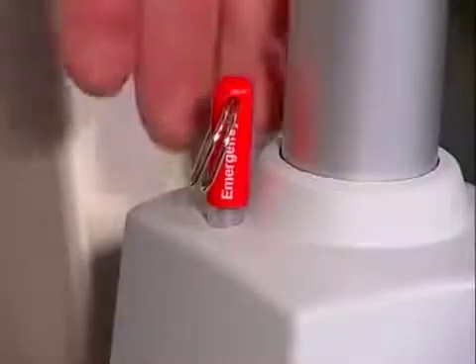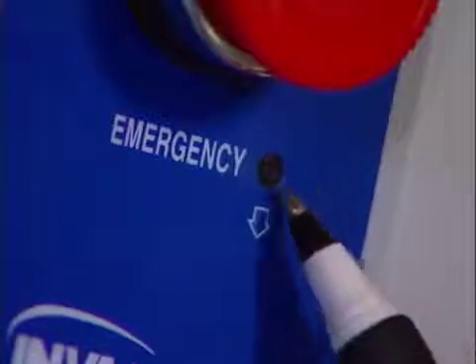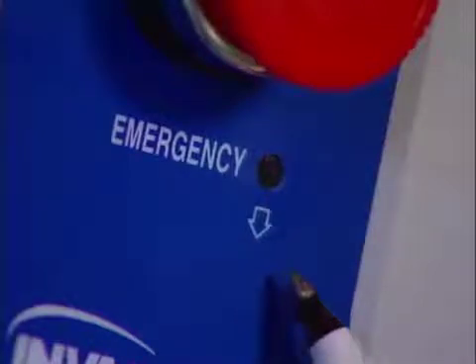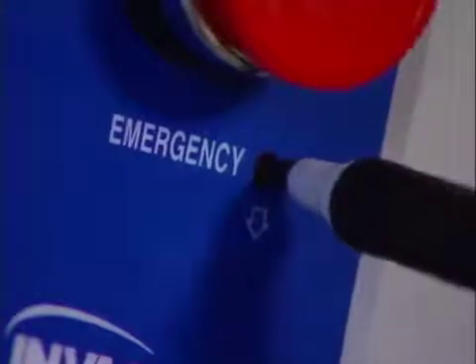Invacare lifts have two: a primary emergency release and a secondary emergency release. To activate the primary release on Reliant models, insert a pen or similar object into this hole on the control box. It's labeled Emergency Down. This will cause the actuator to retract and slowly lower the boom.